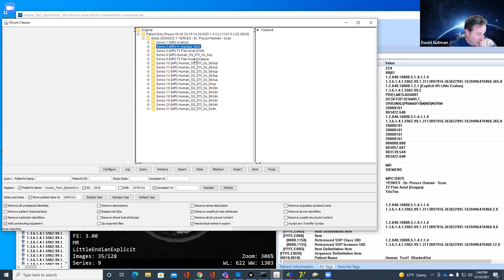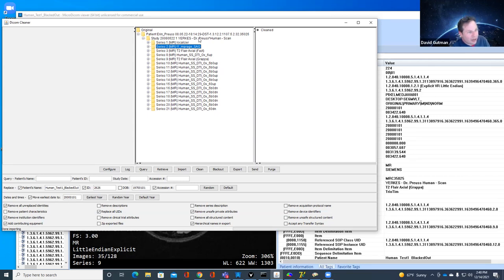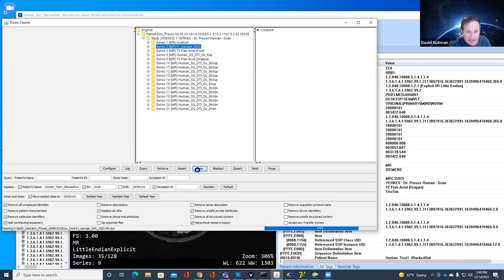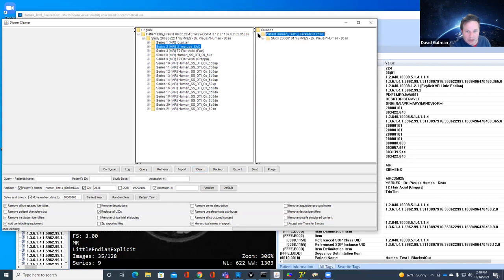This matters, for instance with novel scans for looking at neuromelanin — it could be possible that the series itself was called something like 'Emory underscore neuromelanin protocol.' If I've decided that my university name shouldn't be shared, there's another place where you could inadvertently release information. So I can remove the series description. I hit clean, it worked and ran really quickly. I now have a clean dataset in terms of the metadata tags.